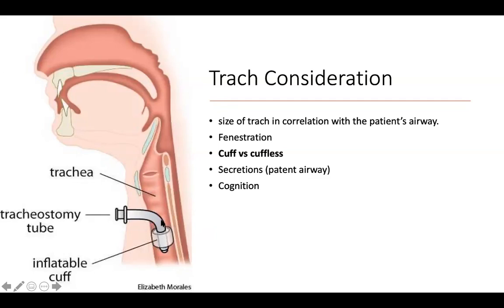So airway comes in different sizes and it differs from one person to another. In women, it's smaller than men, but even among women or among men, it differs. So you need to make sure that that trach has enough space around it to allow the air to escape to the upper airway, okay?